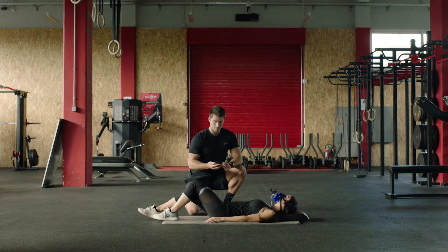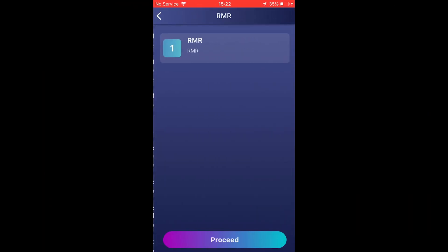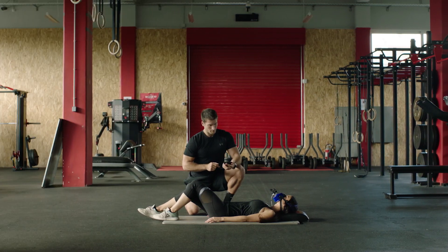To do an RMR test, you follow the same steps as the exercise test. The only difference is that you need to select the RMR protocol. The RMR should last 10 to 15 minutes.